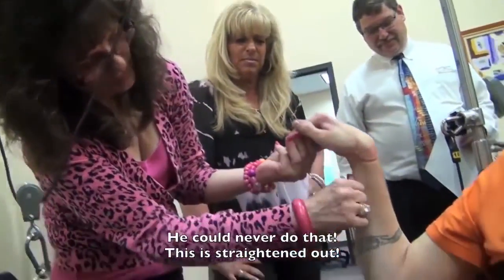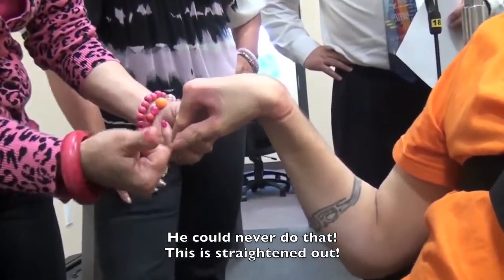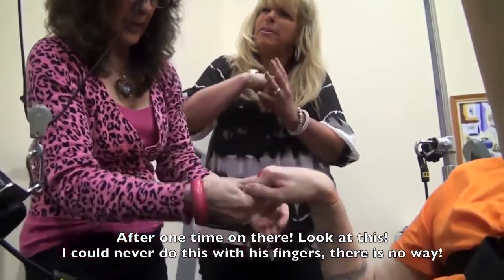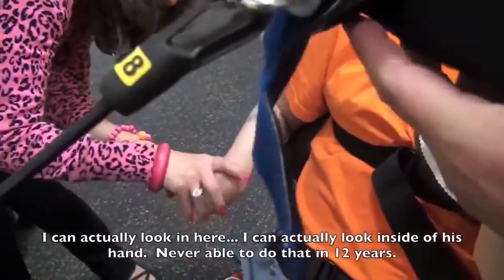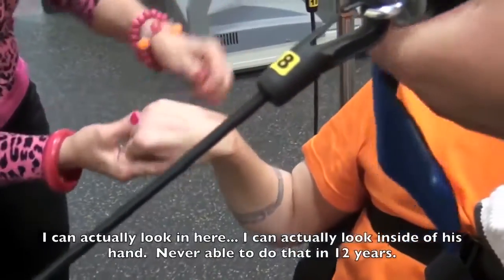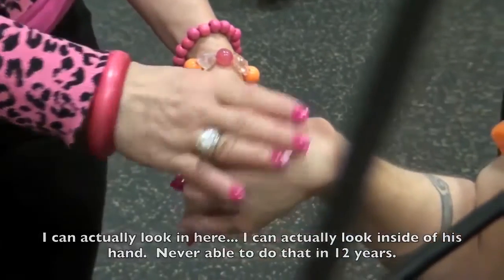This arm has straightened out — he could never lift that arm up. And this hand, which was completely closed — you couldn't even bend the fingers without feeling like you'd break them — he can now give a thumbs up. You can actually look inside his hand. He's never been able to do that. In how long? 12 years.